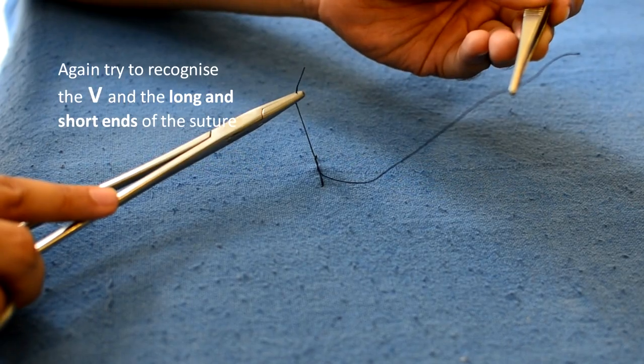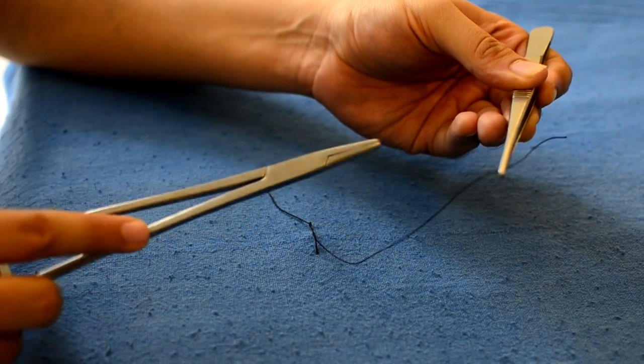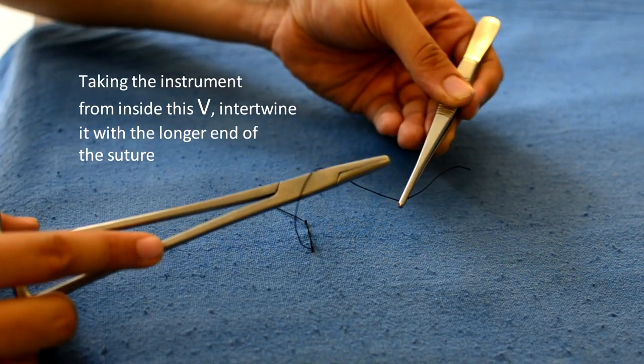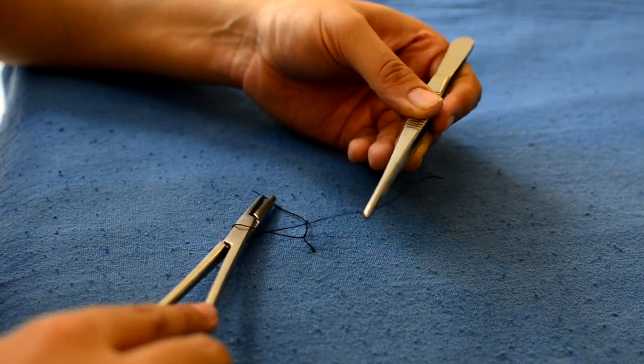Again you should try to recognize the V and the long and short ends of the suture. From within the V, the instrument is again intertwined with the longer end of the suture. This time only once and then the short end is pulled out.